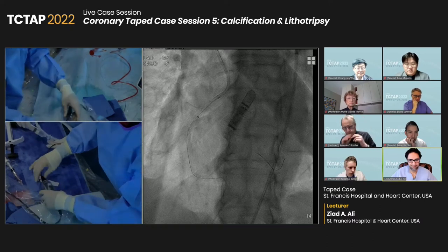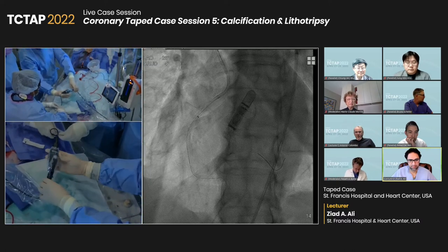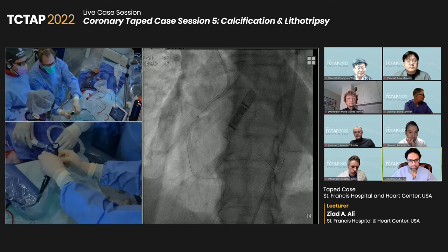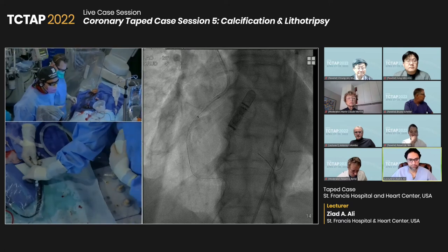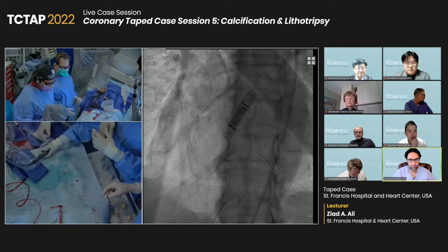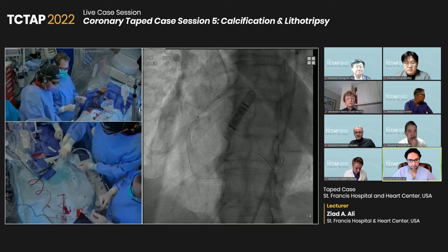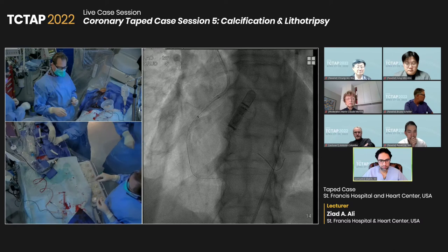Okay, so we're connected. Is the shockwave power on? What I like to do once it's connected is get this sleeve a little bit out, so you know you covered everything. When the shockwave turns on, it's telling us that we have 80 pulses, our catheter is a 3.5/12. On standby mode you're on amber, and when you click therapy, it will turn green, meaning you're ready to shock.